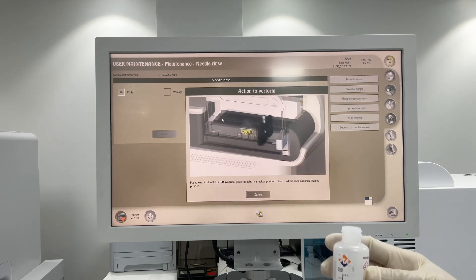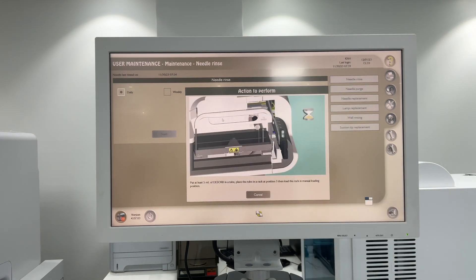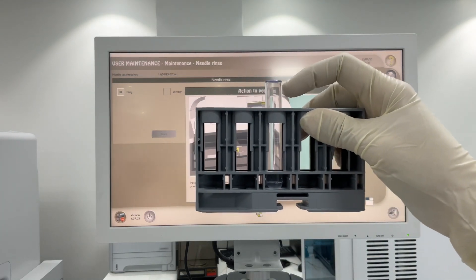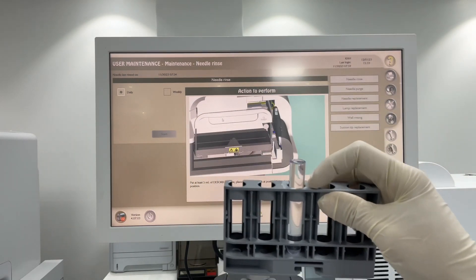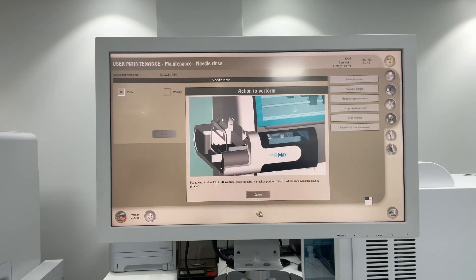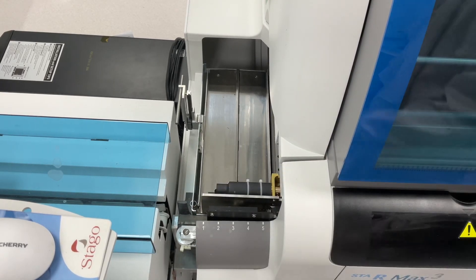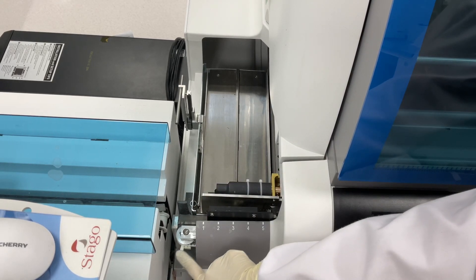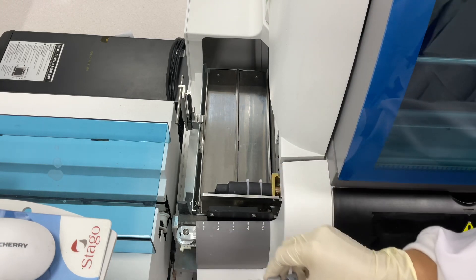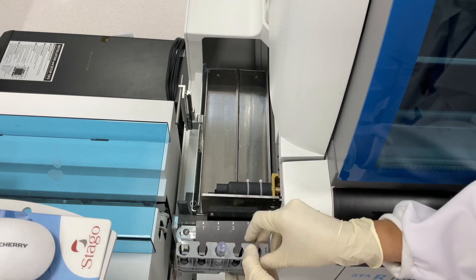There is a 5ml tube in the number three position. Here on loading and unloading of racks, check that the rack is outside, then number one.